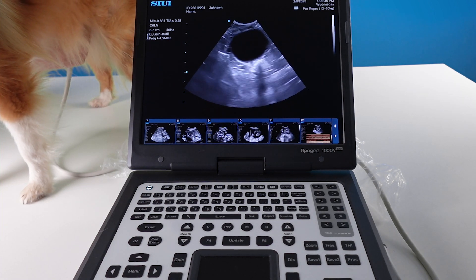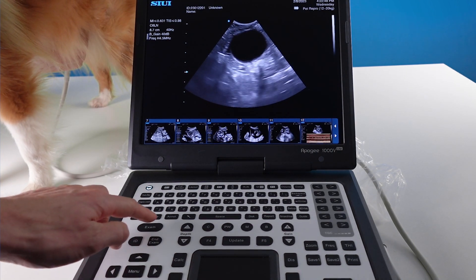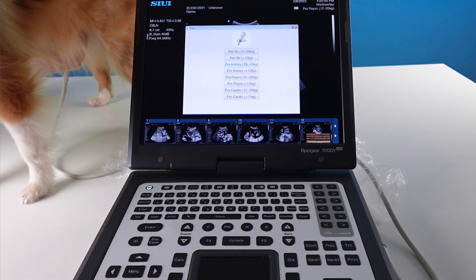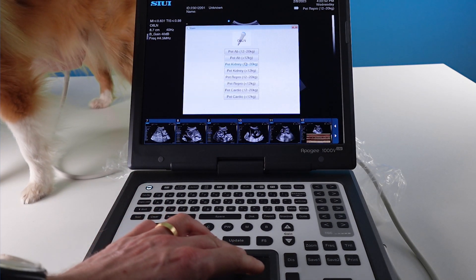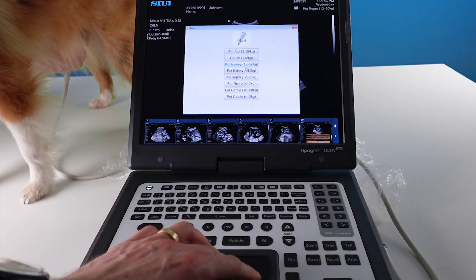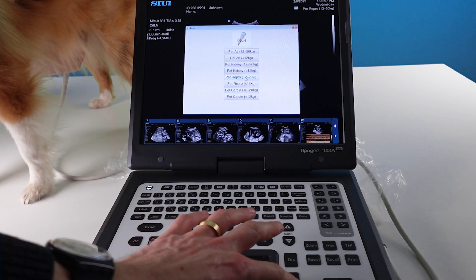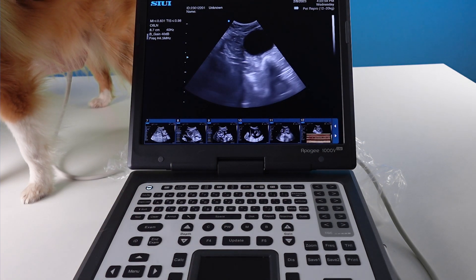First of all, make sure you are in the right exam type. To do this, hit exam and make sure you are in Pet Repro. Hit set to go into Pet Repro.